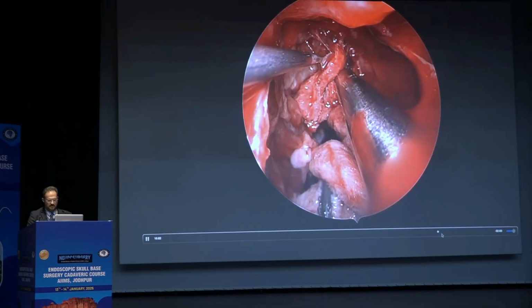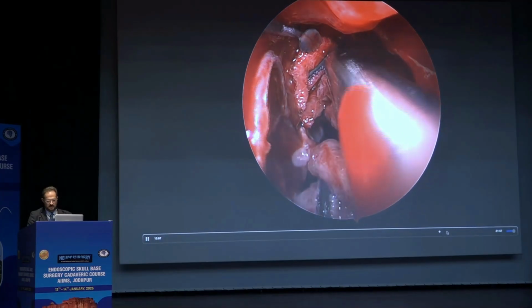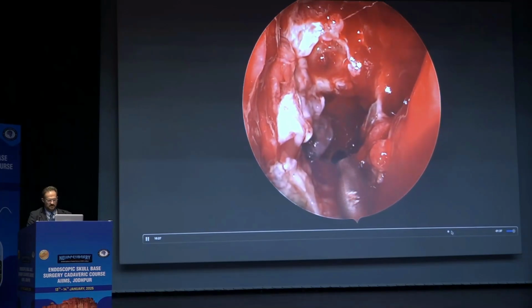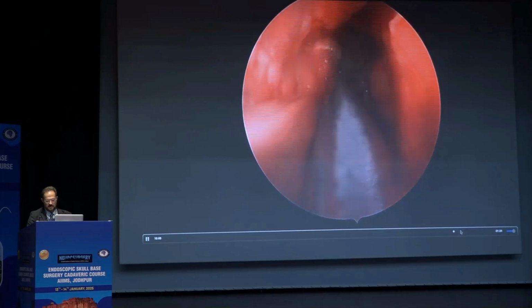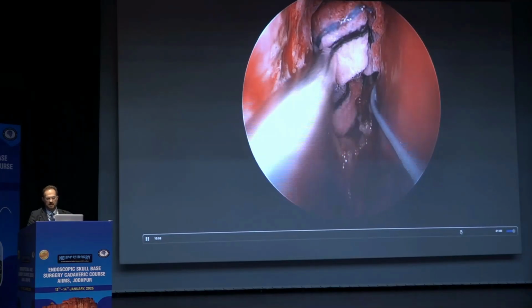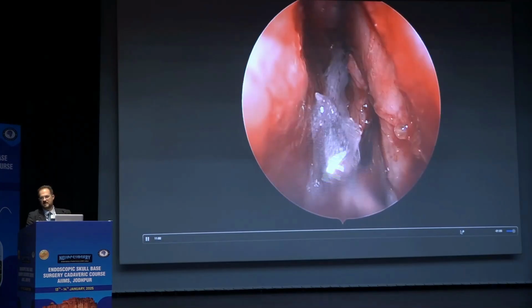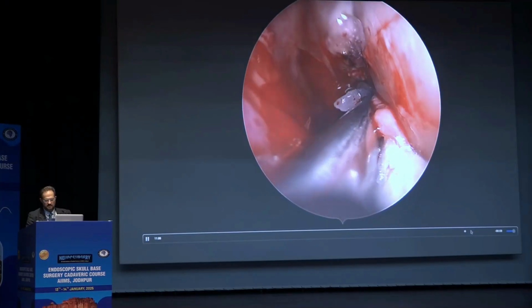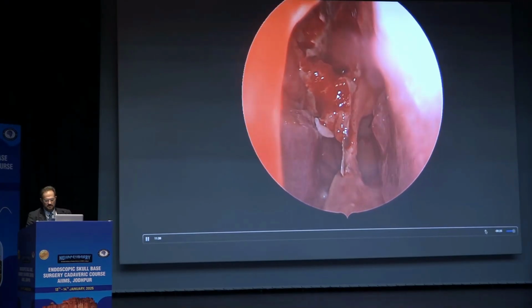We were able to carefully bring that planum down, and the muscle was in position. It worked very well. So no more bleeding. This is the second surgery after elevating everything. And then eventually, 6 months later, I brought her back and did a craniotomy to get the meningioma out. I decided not to go through the nose again. But it was just muscle, and we did several angiograms and then CTAs. She never developed any pseudoaneurysm, this one.